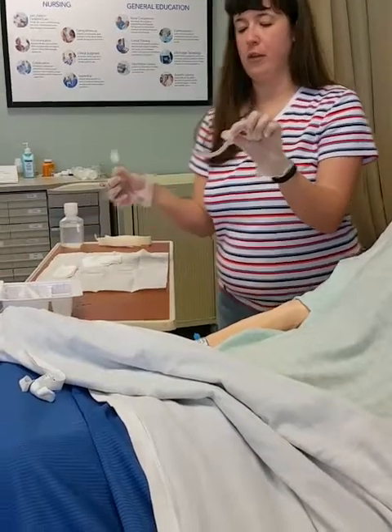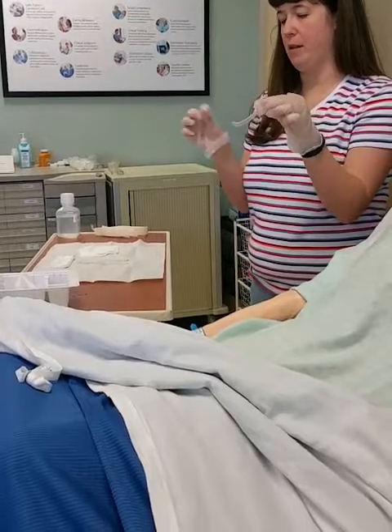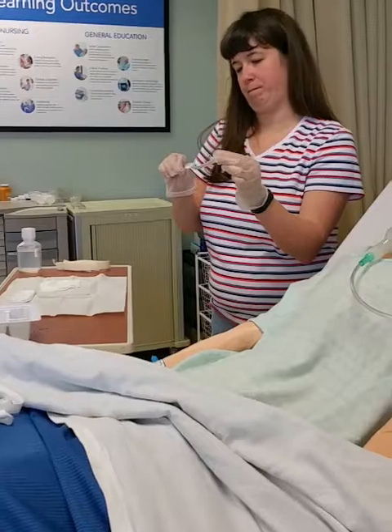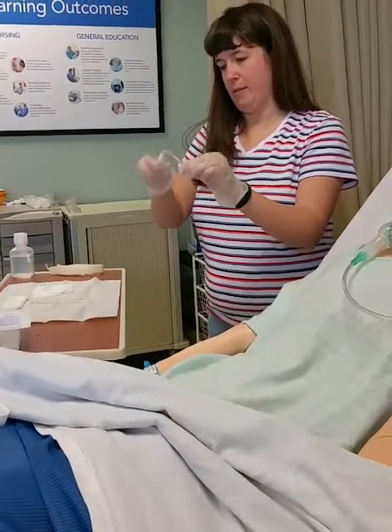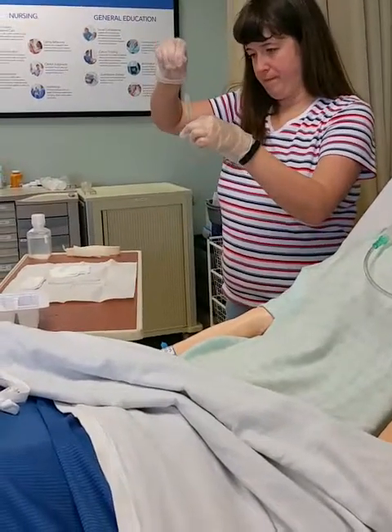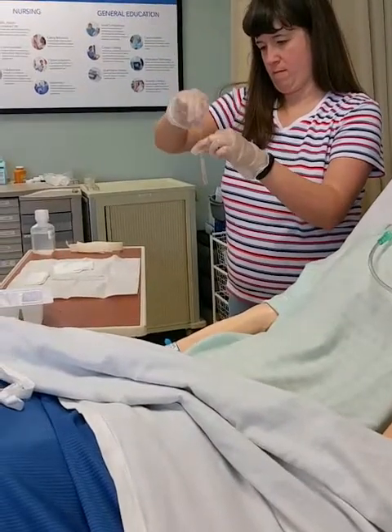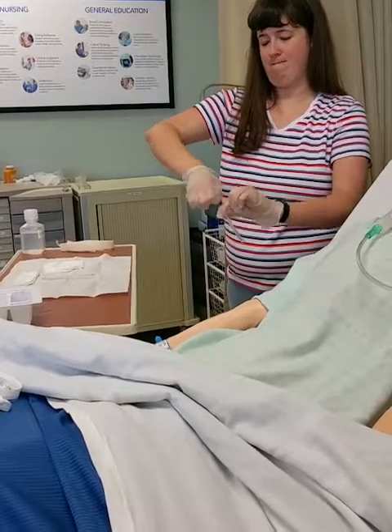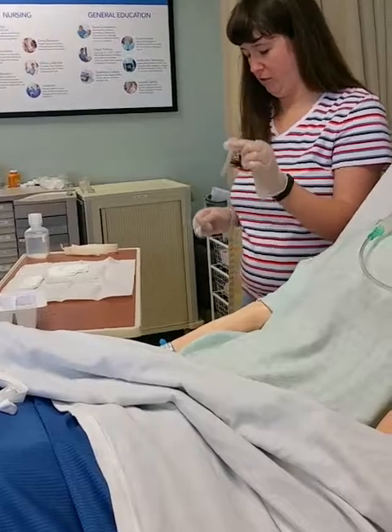You can go from either end. The problem is going from the top, you run the risk of contaminating the brush. It's hard to get it to go in the bottom is the problem. Okay, well, from the top. Okay. Stand back from your sterile field because you don't want to go flinging this all over your sterile field.